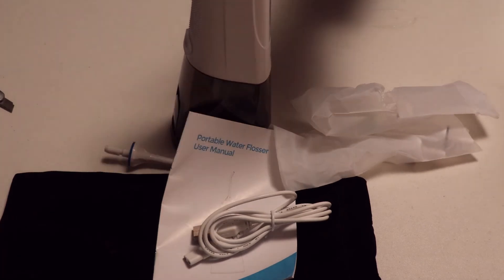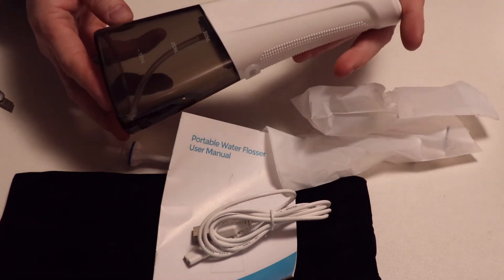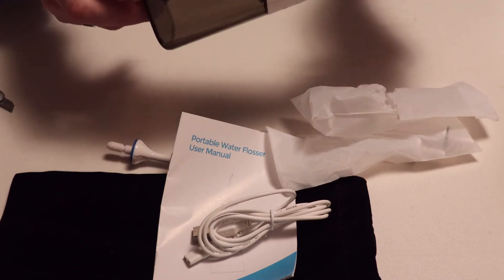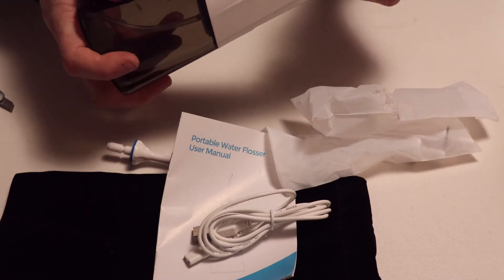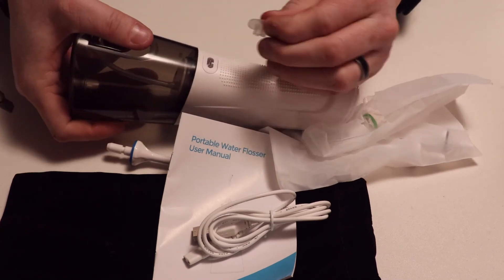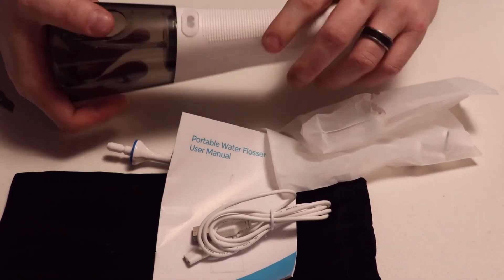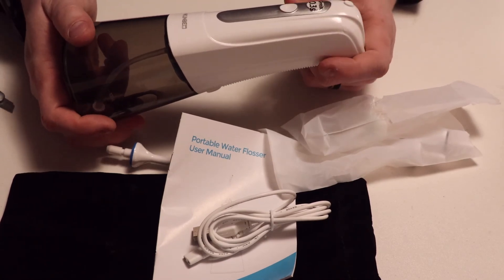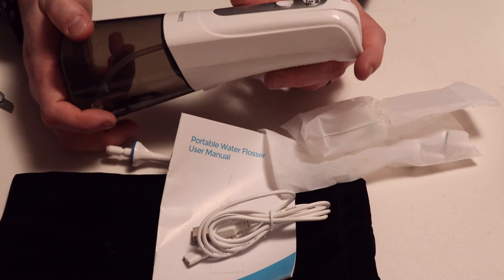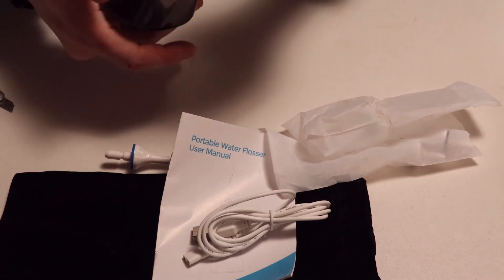And then the device itself. It's pretty light, it's pretty compact, easy to fill reservoir — don't even have to take it off. Looks like you plug it in on the back here, and the power button is on the front. It looks like it has normal, soft, pulse, and DIY for modes.